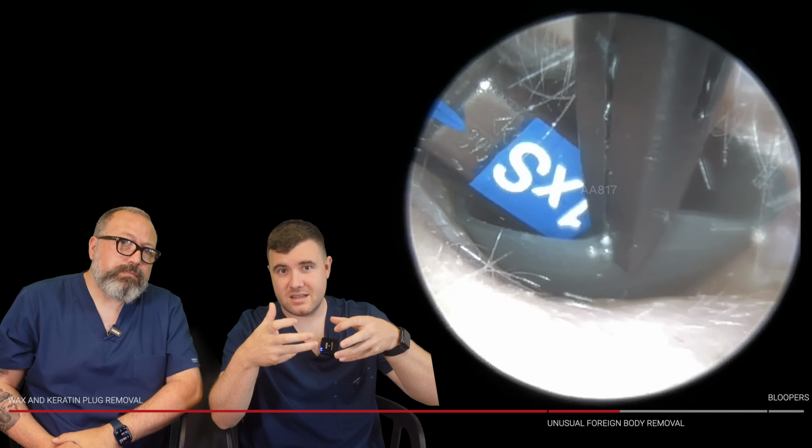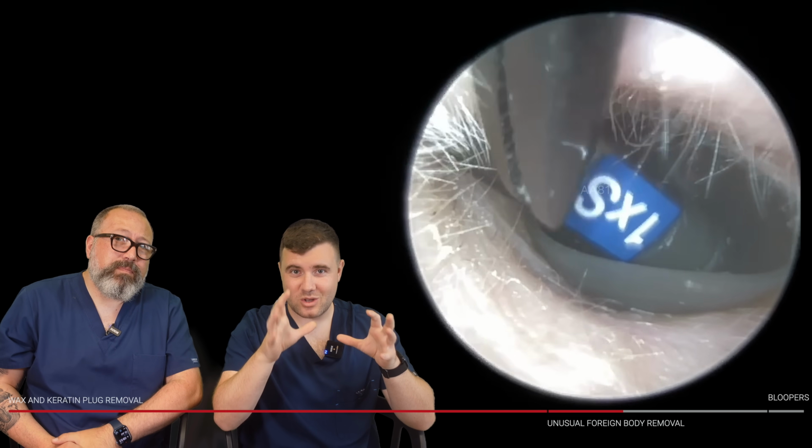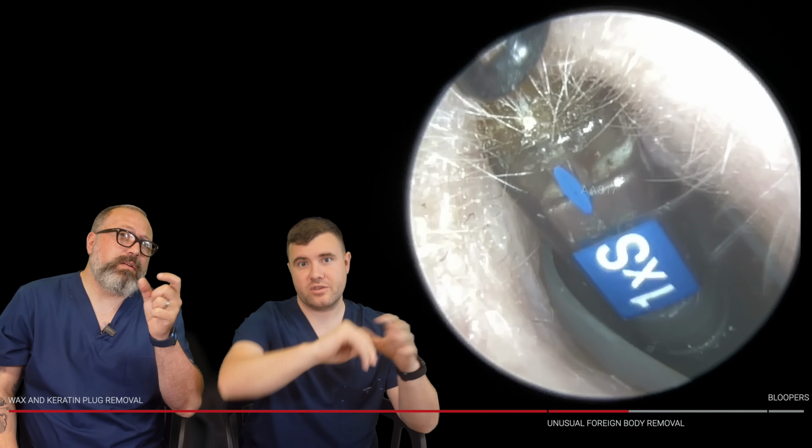Yeah. Now I wanted to see if this dome would just slide and roll here, but God, that is wedged in there. So it's not going to go anywhere because basically that receiver is anchoring this dome in place. This side on your screen. Is the receiver too wide to get the crocodile forceps on as well? Yeah. So you just can't get the grip on it?